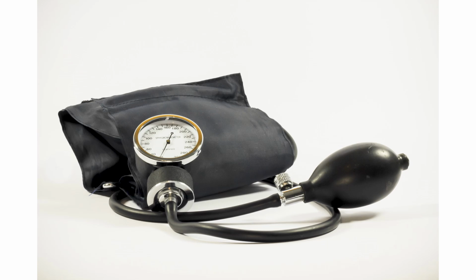The same effect is observed in the manometer needle when the pressure falls below the systolic pressure. It starts oscillating slightly and the oscillations stop when the cuff pressure falls below the diastolic pressure. This is known as the oscillometric method of measurement of blood pressure. This oscillation of pressure within the cuff is used by automatic blood pressure measurement equipment using pressure sensors.